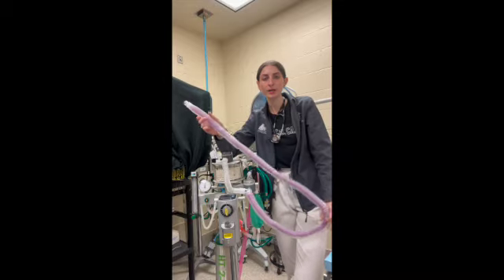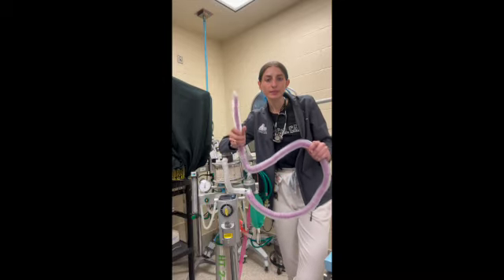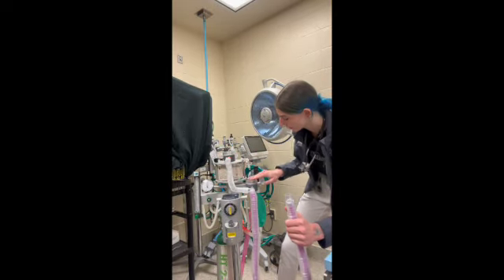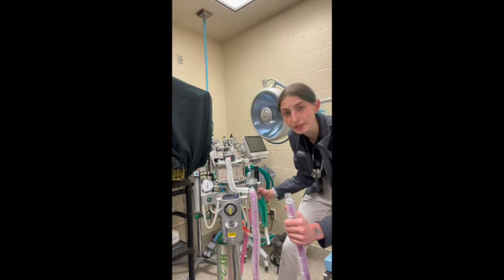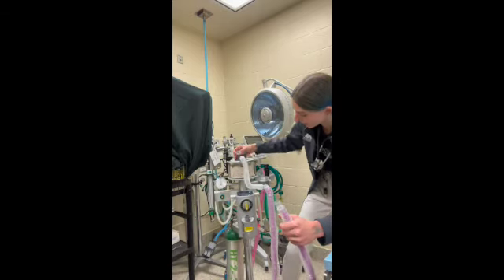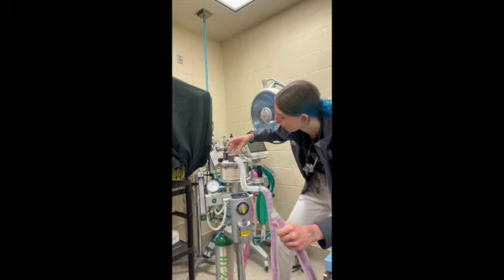So we're going to go over the different parts of our anesthesia machine. Right now I currently have a rebreathing circuit attached. This is going to be our inhalation valve here, and that's going to be connected to our reservoir bag that's going to hold the oxygen and any anesthetic gases that we'll be utilizing. Here in this port is our exhalation connection port and valve.